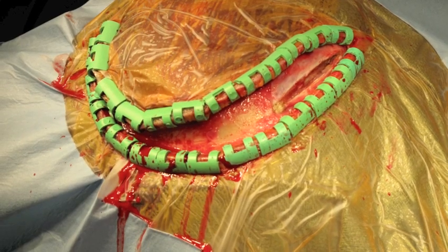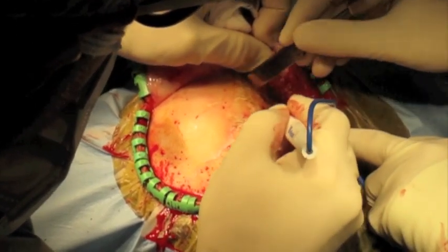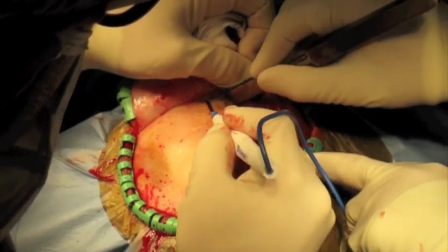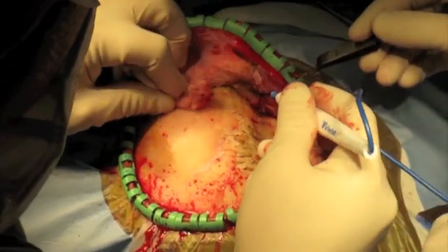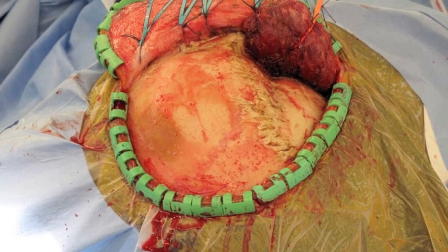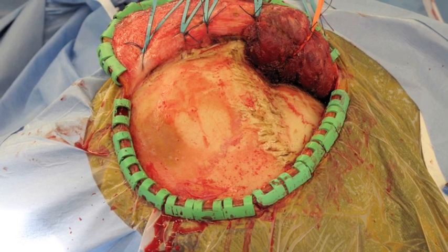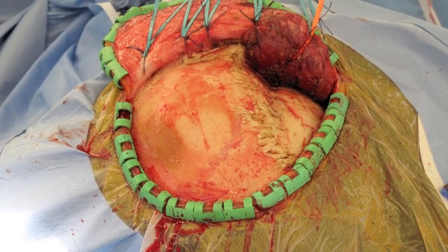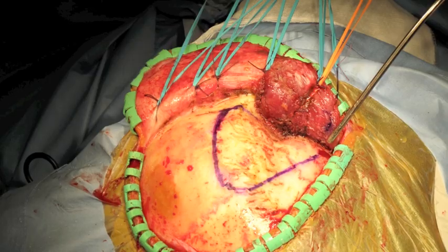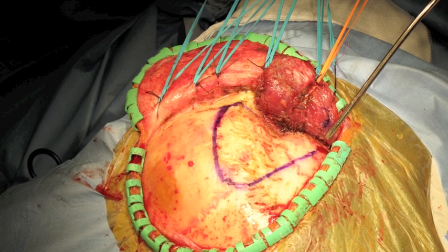The temporalis fascia is then sharply cut and the muscle elevated forward using a combination of blunt dissection with the periosteal elevator and cautery to disconnect from the superior temporal line. Once reflected anteriorly to expose the orbitozygomatic arch, heavy Vicryl stitches along with rubber bands attached to a Leyla bar maintain exposure. The planned craniotomy is outlined and an initial burr hole is placed low in the temporal region where the bone is thinnest.